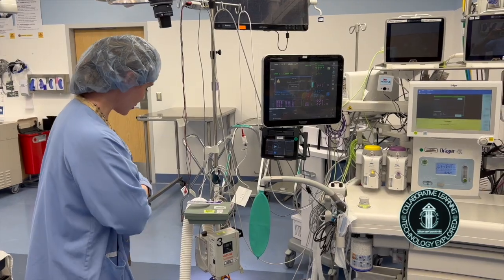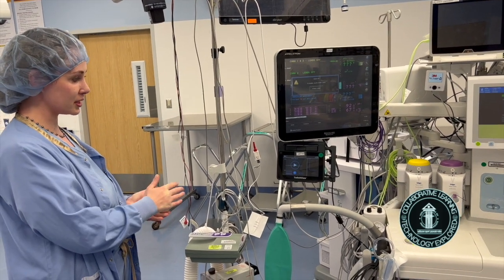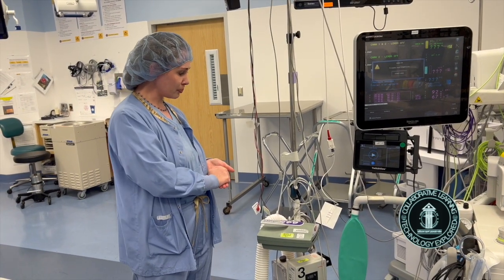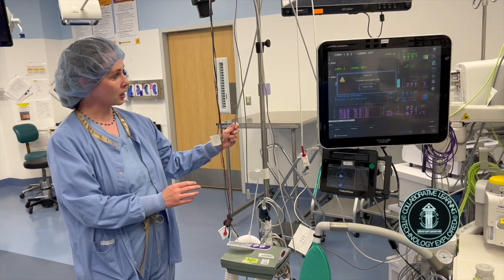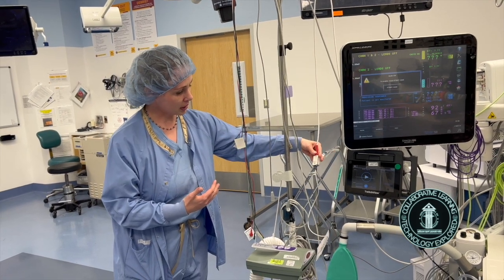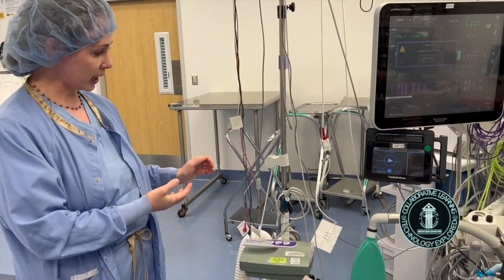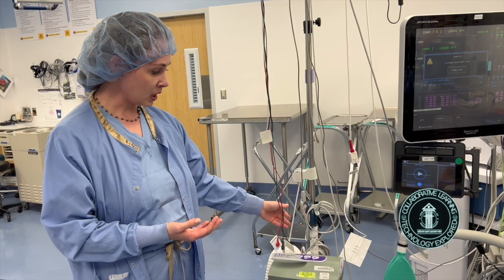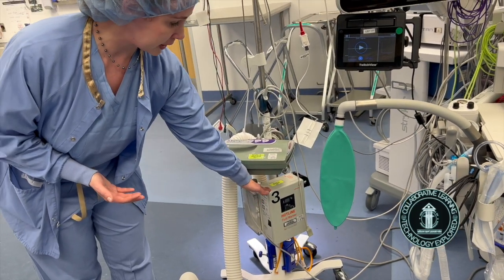Absolutely. Hello, again, my name is Irina Tugayeva, and I will show you our workstation here. So this is the anesthesia machine, and we have a few monitors here. We'll start with the basic ASA monitor. So we have EKG here. We have a blood pressure cuff that is not attached to it, but it measures blood pressure. We have pulse oximetry. We also have a temperature probe here. On top of those monitors, we have a BIS monitor that is used on almost all adult patients at this point of time. We have a fluid warmer and one more rapid fluid warmer device.